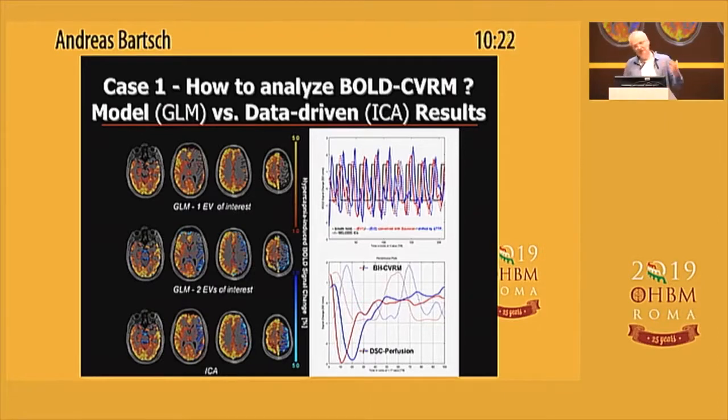And now, this I find kind of cool. If you look at the components you get from the ICA, and you don't put anything into the ICA about your known perfusion delay, you have these components, and if you measure the distance between the peaks, this is just 9 volumes at 1.1 seconds.